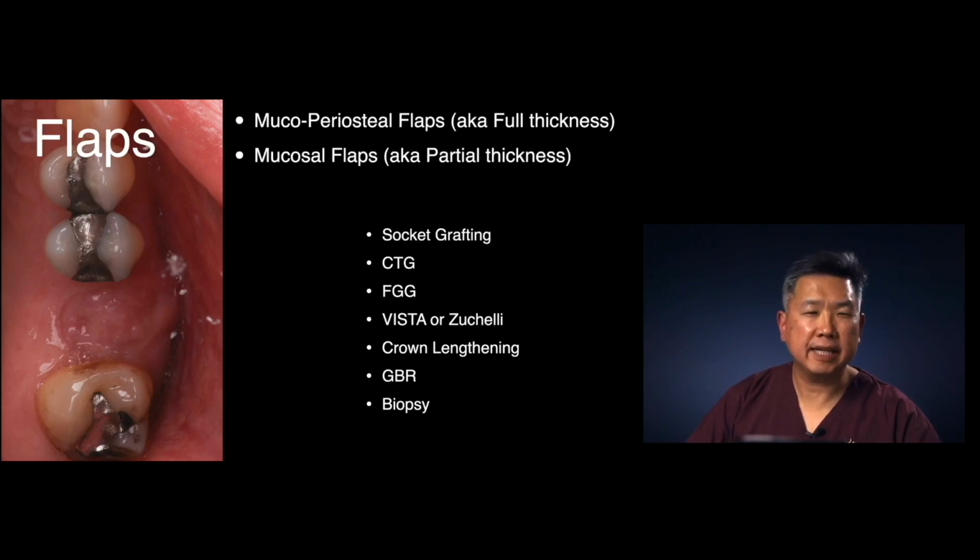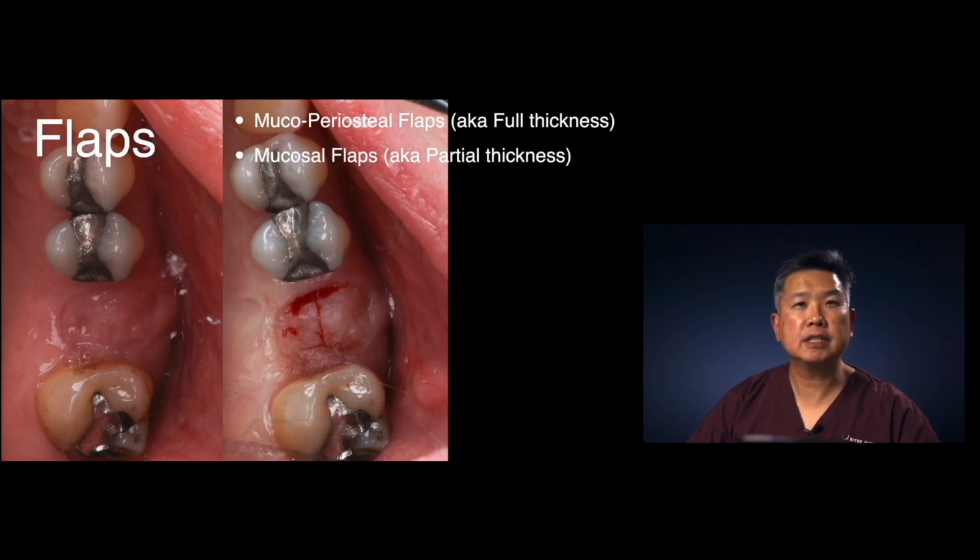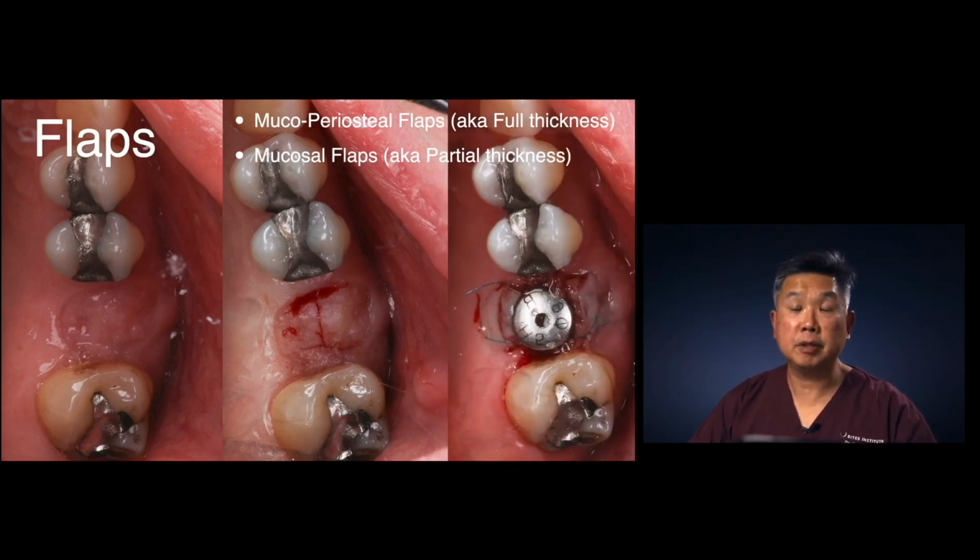So in this particular case, I can't remember, I think I'm placing a fixture after this. So this is a healed open membrane technique socket, and I'm placing a small fixture. I could have punched it, I realized that, but I decided not to punch it. I decided to make a small micro incision and just place my implant that way. And then I wanted to take that flap and reapproximate it buccolingually to the healing abutment, because I wanted to utilize that beautiful amount of keratinized tissue that came about as a result of that open membrane technique.